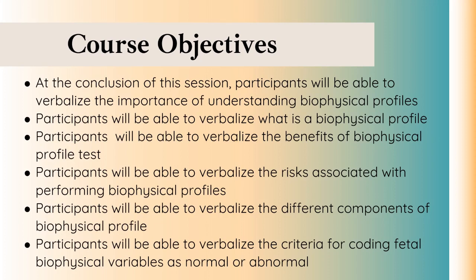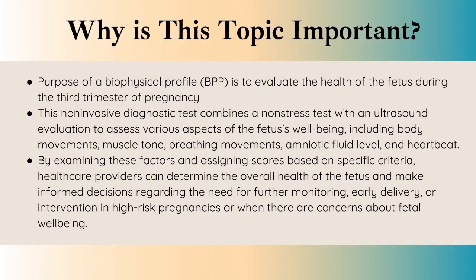as normal or abnormal. This topic is important because the purpose of a biophysical profile, or BPP, is to evaluate the health of the fetus during the third trimester of pregnancy. This non-invasive diagnostic test combines a non-stress test with an ultrasound evaluation to assess various aspects of the fetus's well-being, including body movements, muscle tone, breathing movements, amniotic fluid level, and heartbeat.